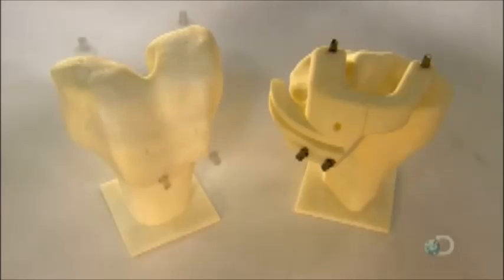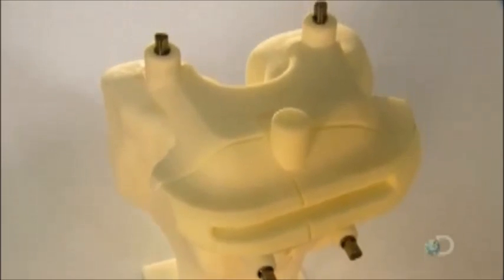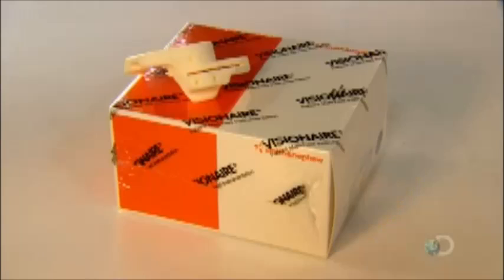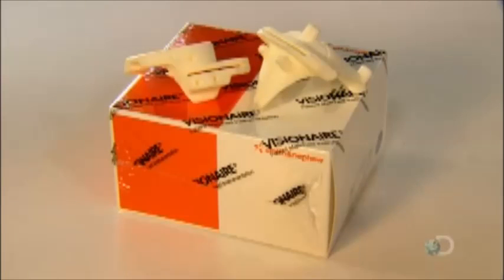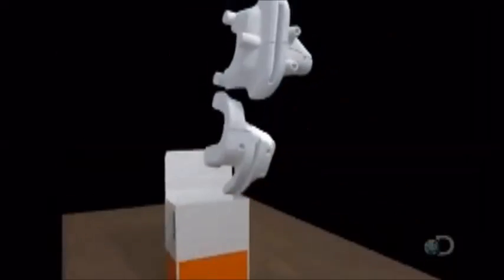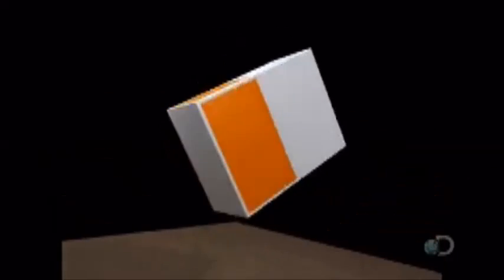All bone cuts are pre-calculated by the computer model. This method eliminates several steps required in standard surgery. Therefore, the operation takes less time and requires half as many instruments to set up and clean up. And because the surgeon no longer has to drill a hole in the bone to check the knee implant's alignment, the patient experiences less pain and bleeding, which means less likelihood of developing complications such as blood clots.